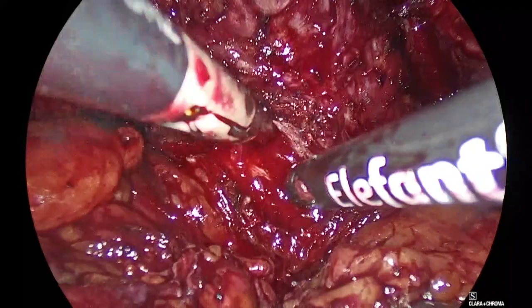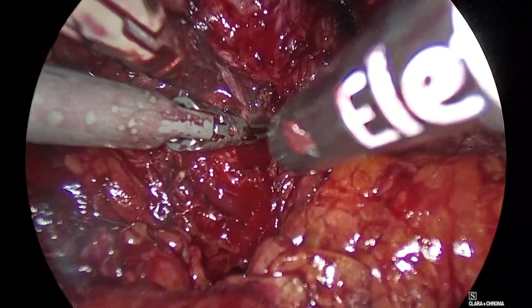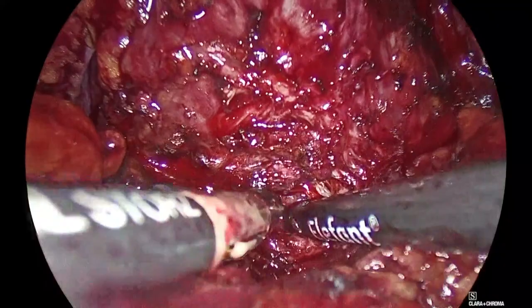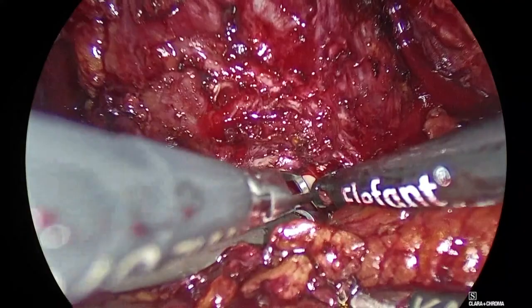That even this bladder neck is not easily... Normally here it comes out very nicely. When you can't do it, there, aspirate. Should be inside now. Yes. Let's look for the catheter. Give me a strong grasper, please. See how everything is stuck in this case on the right and the left. Eh? It's not very possible to do a nice bladder preserving technique.